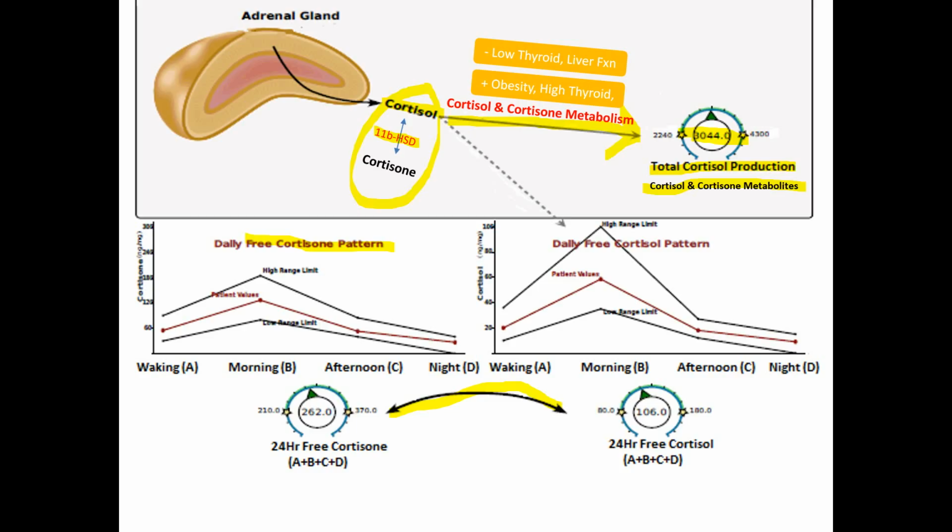The other thing we can see, as we said, is there a major preference for this particular patient to deactivate the cortisol and leave it in cortisone form, or is there a preference the other way? And the way that we look at that is not as much to look at the free pattern, because the free cortisol is about 1%.